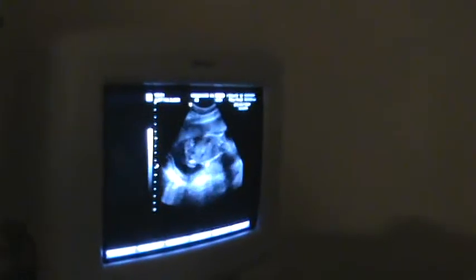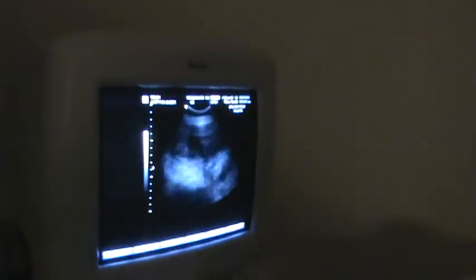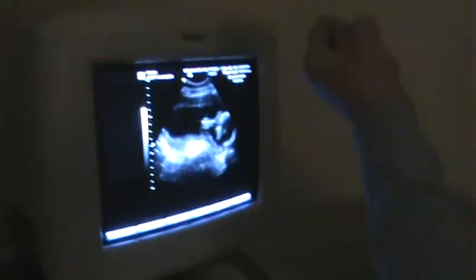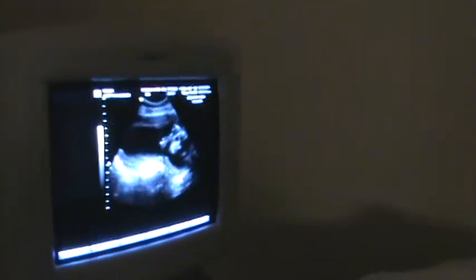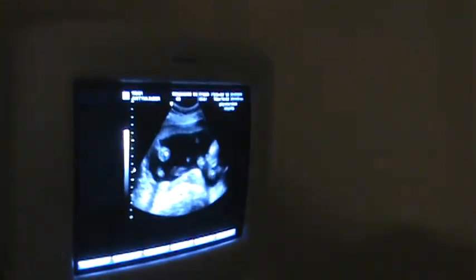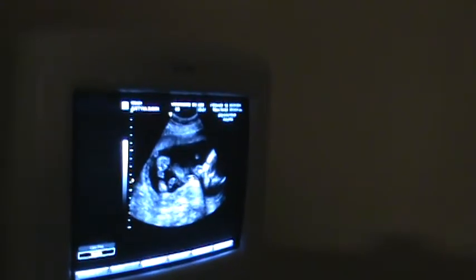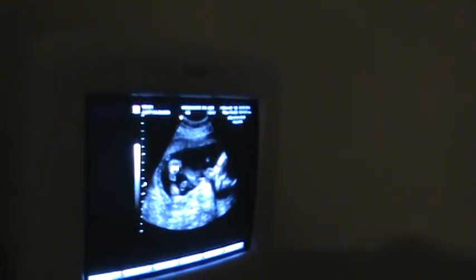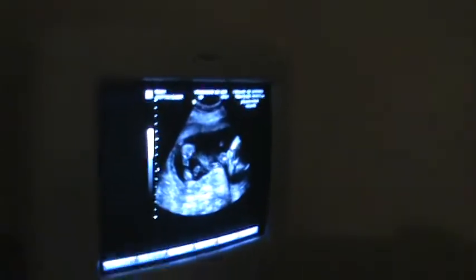Do you see the leg kneeling? Ready to jump off at any given moment. He's like, I could put my hand on my head and bump that heel away — oh, that pushy woman leaves me alone. Come on, flash the boy parts for everybody. There they are, right there. Really embarrassing by 30 weeks when your child is three and a half pounds — now we can embarrass them in the future. Right now they're harder to believe.